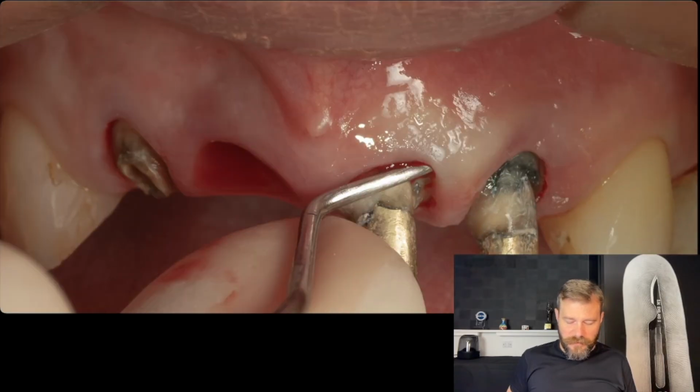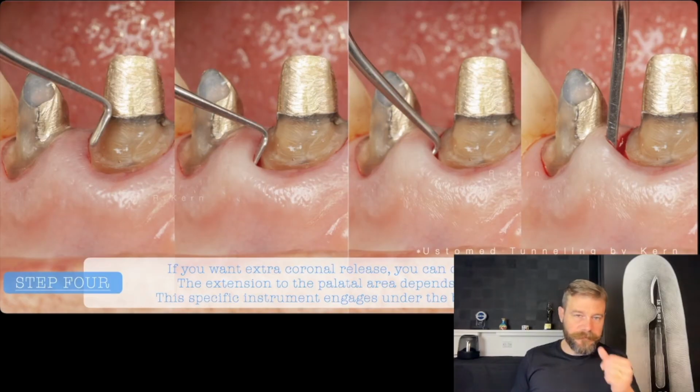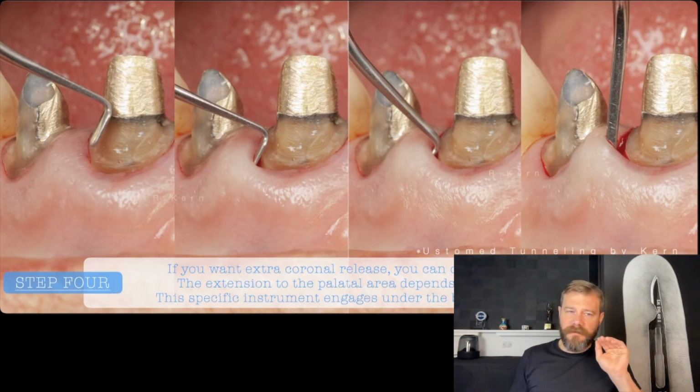Okay, then it's going to be the next step. Here I have all this tissue free already, even the papilla side, everything is completely free. So Ricardo, what can I improve on the flap management? In some cases, I want extra releasing of the papilla base. In some cases, when you have larger papillas, we can even bring a little bit of the connective tissue graft under this buccal side of the bone peak. And I need to make this papilla a little bit more free.